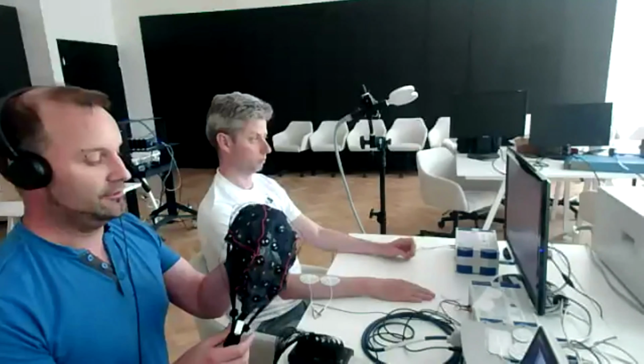So we use 16 electrodes over the motor area. And then there are some more in the back.